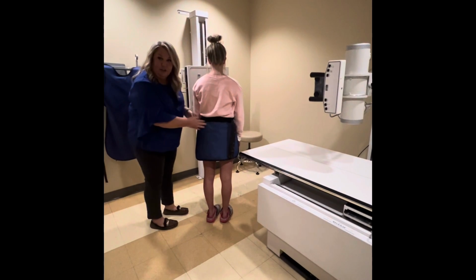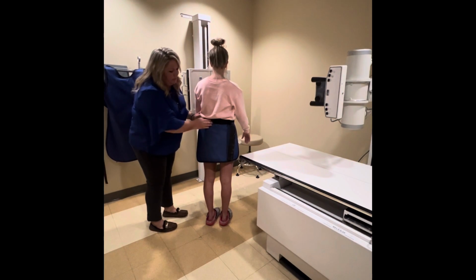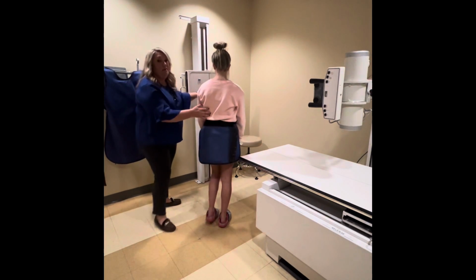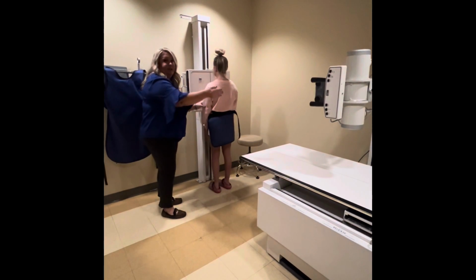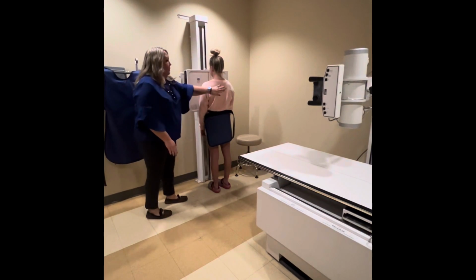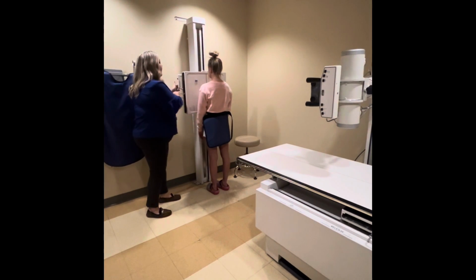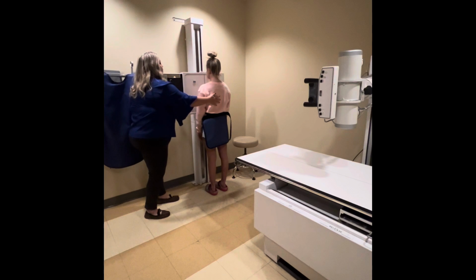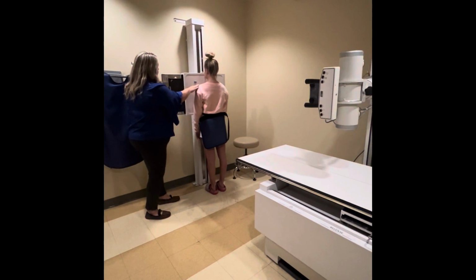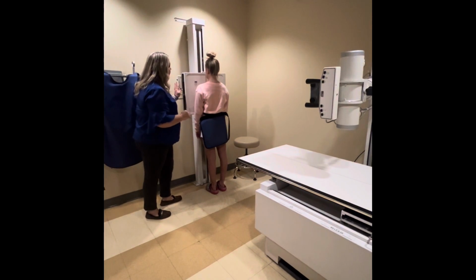So we've already wrapped the shield around her. We're going to make sure that she's good and protected. With these types of shields, you want to make sure that the shield part is at the back, because as she stands in the PA position again, those x-rays are going to be coming from this direction. So we've got our patient over here. She's in the PA position. We want to make sure that our image receptor is about 1.5 to 2 inches above the level of her shoulder. So there's her shoulder, so our image receptor is about 1.5 to 2 inches above.